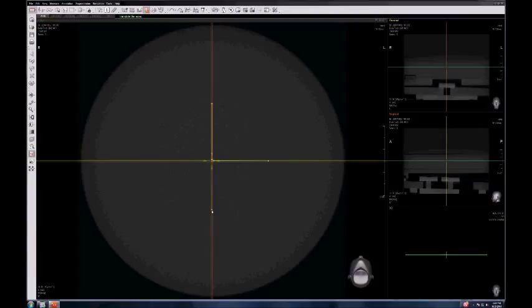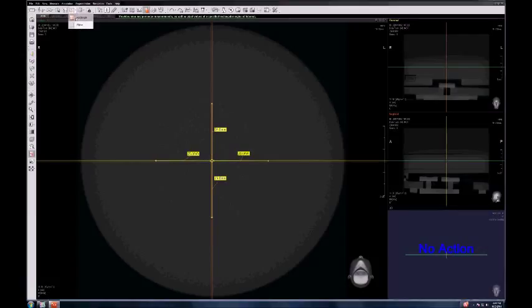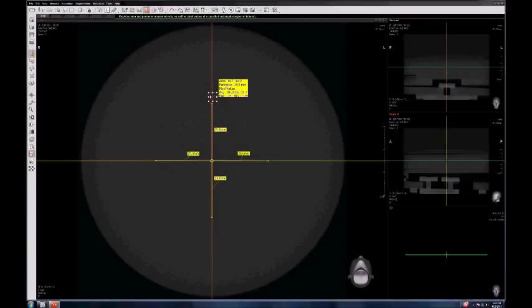So this is our third distance here, 25 millimeters as well. And finally, let's create one more, about 25 millimeters away from the center. Okay, so using those four distances as a reference, let's create now our regions of interest, which will be positioned at the end of these distances.